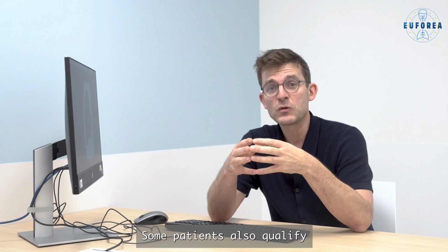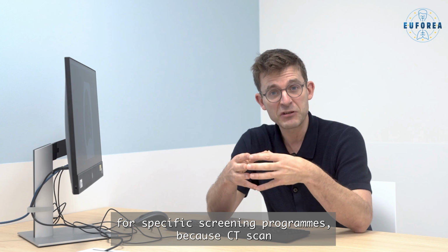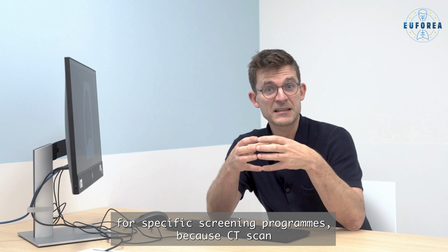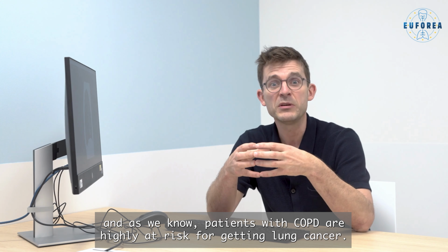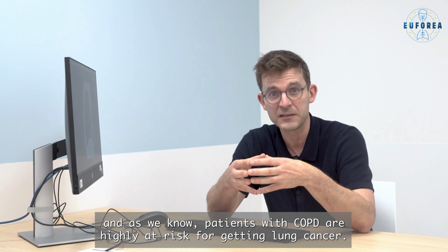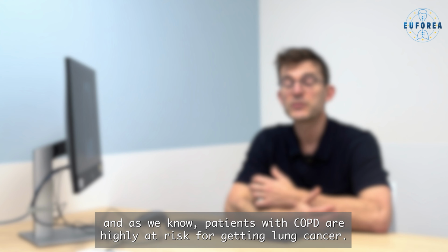Some patients also qualify for specific screening programs because CT scan is very sensitive also in detecting lung cancer. And as we know, patients with COPD are at high risk for getting lung cancer.